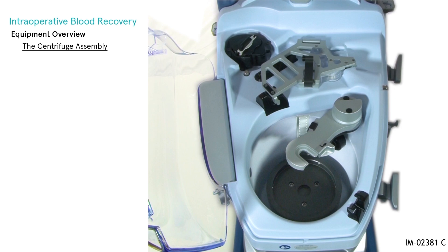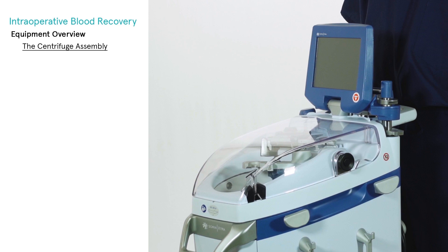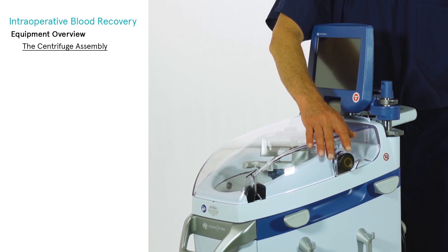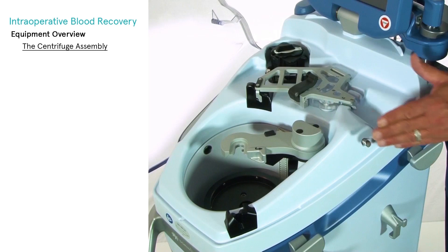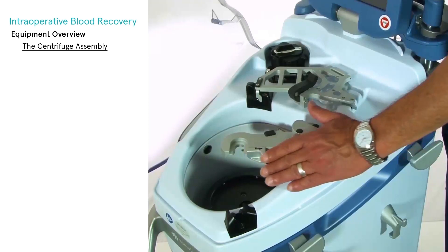The centrifuge assembly is located at the front of the machine and includes a centrifuge lid, a centrifuge plate, and a centrifuge arm. To open the centrifuge lid, press the button located in the center of the lid locking mechanism on the right side of the machine, and lift up on the lid. To close the centrifuge lid, push it down. The centrifuge arm swings forward to lock, and backward using a thumb slide to unlock.